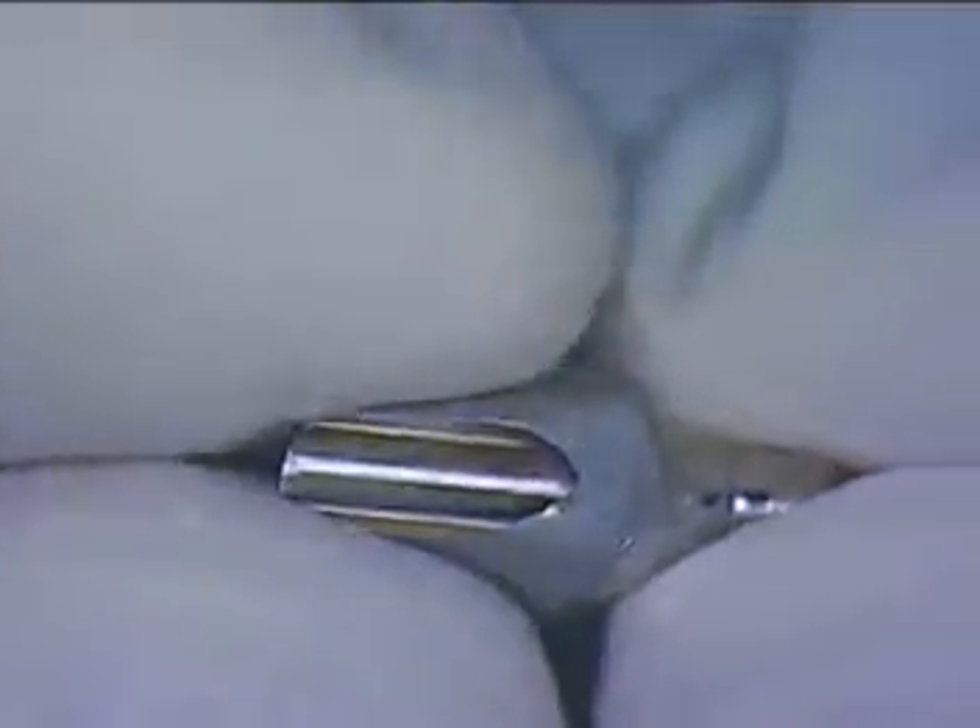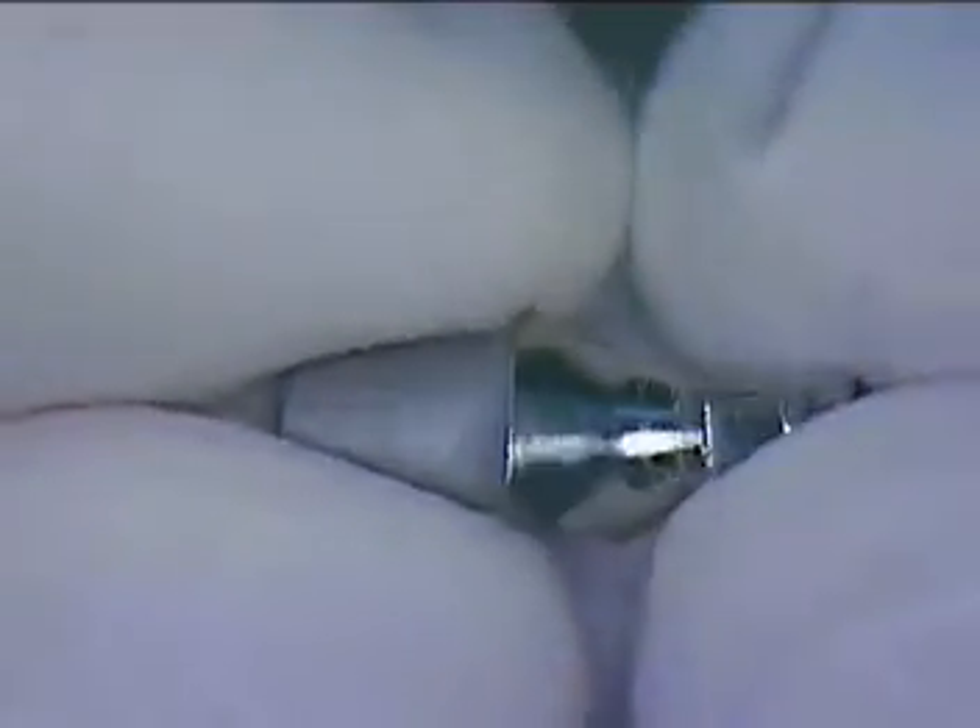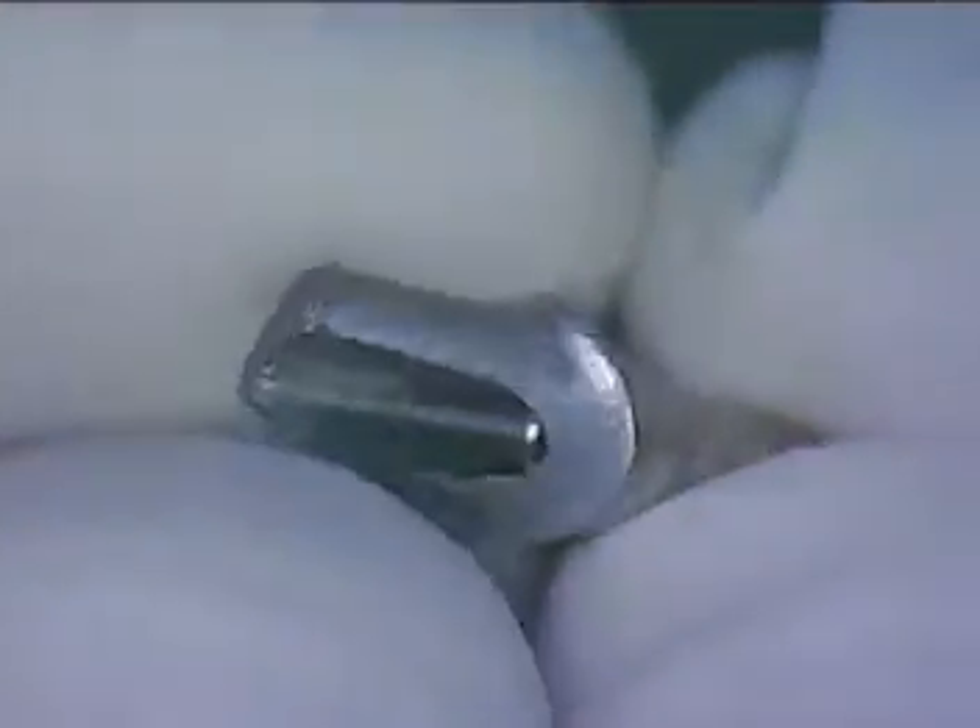We are back live here again looking at our now sandblasted abutment. There's a big difference when you have an abutment that has a matte finish — when the cement attaches to that you'll get a little better bite, a little better bonding. And then the highly polished area is going to go toward the soft tissue.